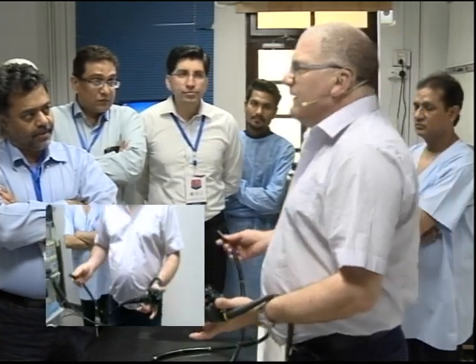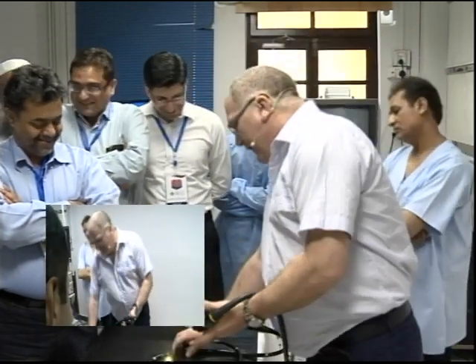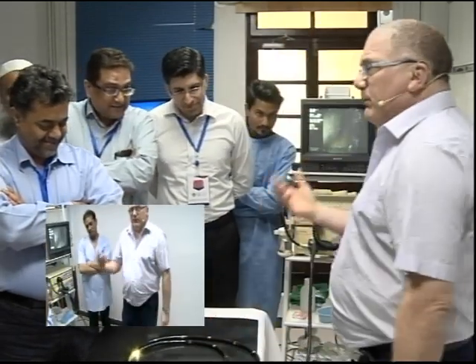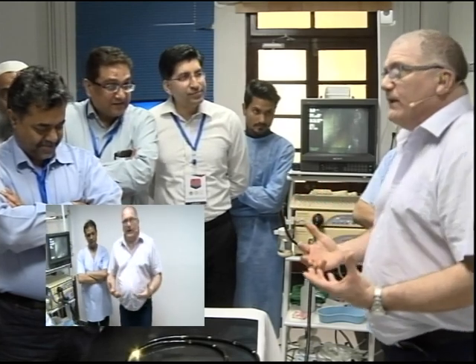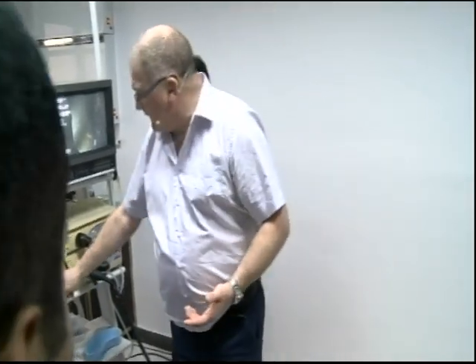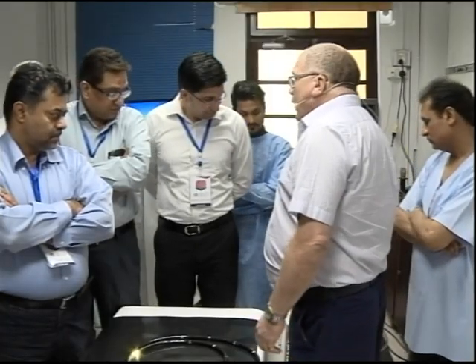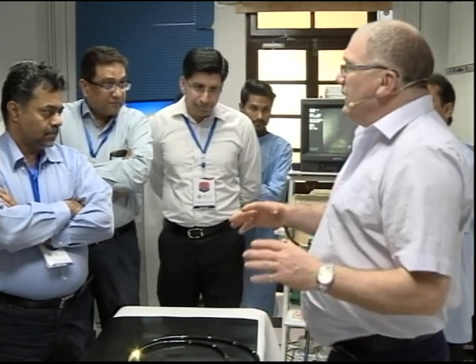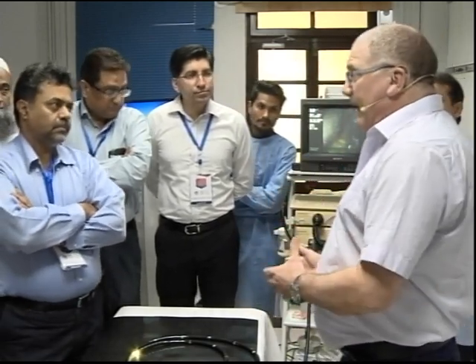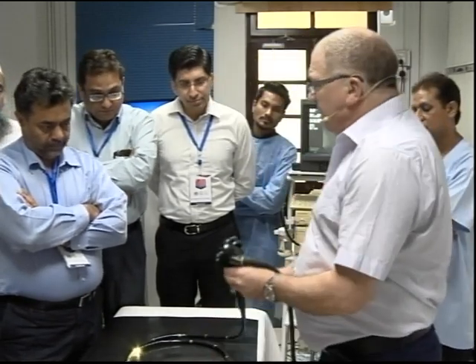If it's basic, why didn't you know before we came? So, the main thing is that you pick up a scope, and if you don't know why it's not blowing, then you've got a couple of things to check. One, are the black seals cracked? Two, is this got a good seal here? Is this connected here? Is this home? Understanding your equipment enables you to be prepared for what you're doing. Right? So if you understand it, you know what's happening.